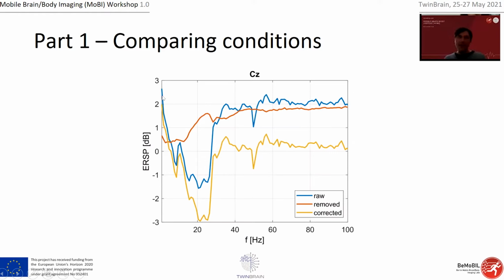Meaning, again, we know that this first trace, the raw trace, is a summation of artifacts plus physiological activities. So if we get rid of these broadband activities that are low for low frequencies but strong for higher frequencies, which is very characteristic for muscle artifacts, we can come up with the corrected power spectral density plotted here. Here we have a stronger effect, and there is still a bit of an offset, but this offset in power contamination for higher frequencies is very much reduced.